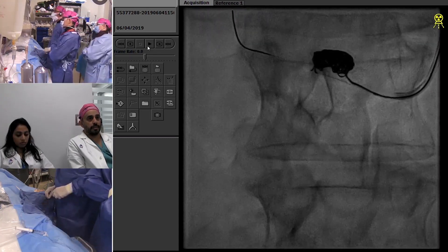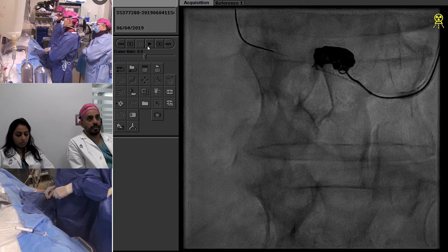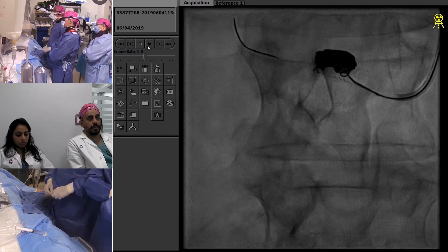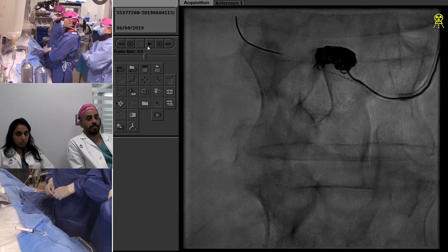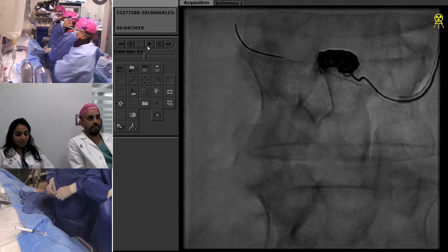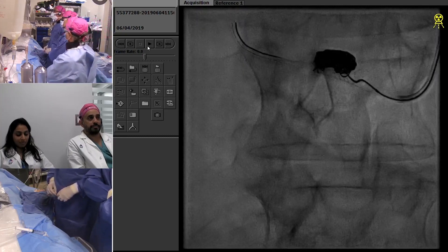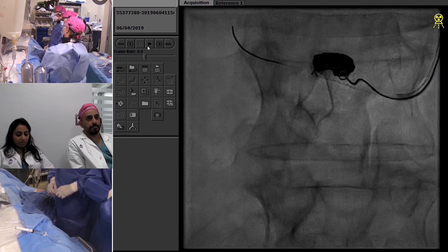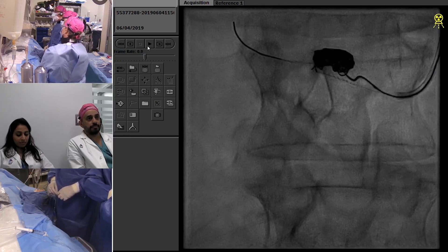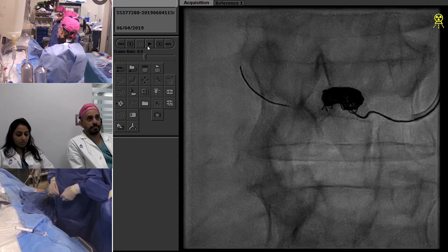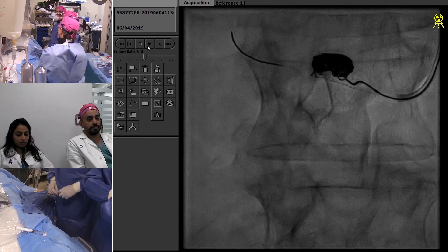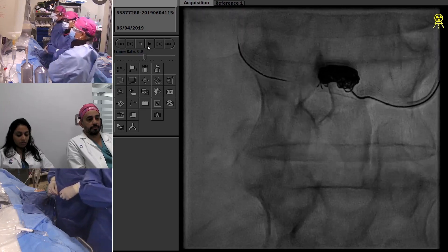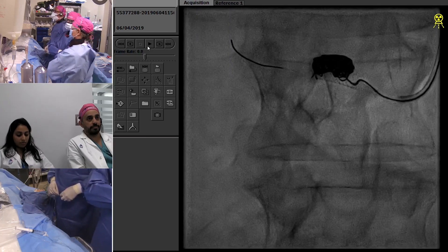This last coil is not going in as easily as I'd like, and I'm being handed off to room one. Either this coil goes in or we're done, as we won't be able to place another. I want to thank everyone for helping on this interesting case — I hope it was educational and I'll likely see you all later.